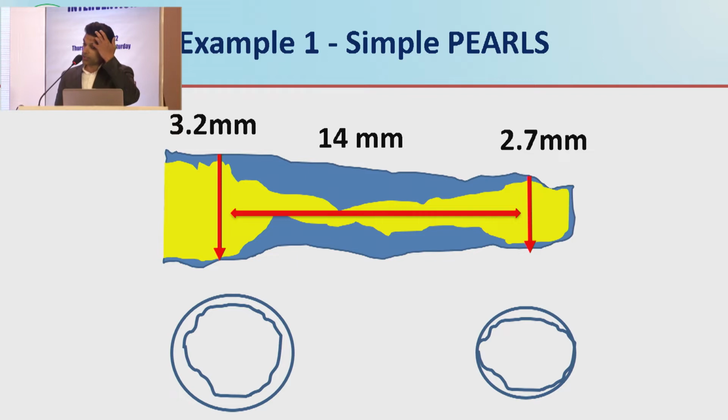So this is easy, right? This is almost any stent on the market. You can take a 2.5 by 15 millimeter Xience stent, or a 2.5 by 16 millimeter Synergy stent, or pick one, right? It doesn't matter. Deploy it, and then you post-dilate using a 2.5 millimeter non-compliant balloon at high pressures at the distal end, and a 3.0 millimeter non-compliant balloon at the proximal end.